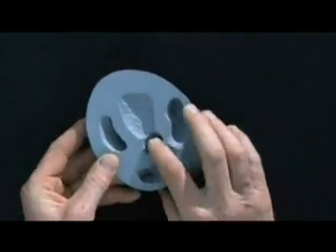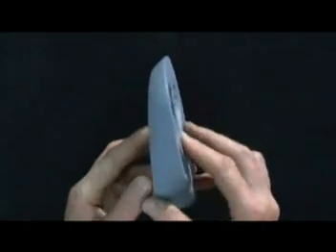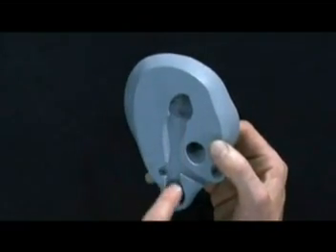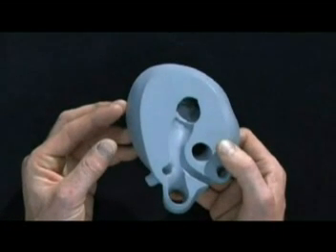If you pick up this slice and just look at the relationship of the aortic and pulmonary valves, you can see just how close they are to each other. The aorta runs more or less horizontally across the chest towards the right side, while the pulmonary outflow runs more or less straight from front to back and straight into the ductus arteriosus.